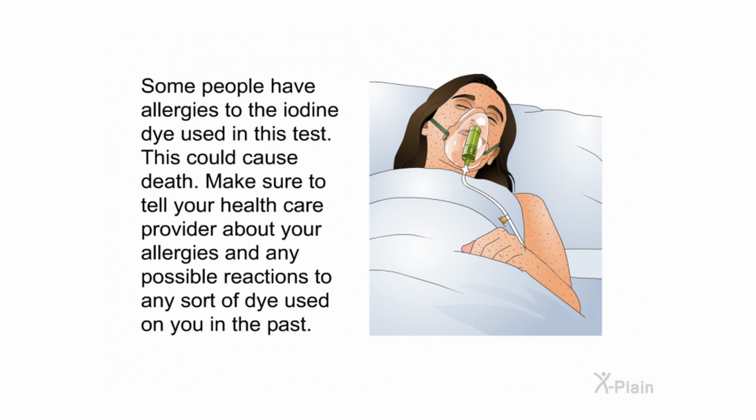Some people have allergies to the iodine dye used in this test. This could cause death. Make sure to tell your healthcare provider about your allergies and any possible reactions to any sort of dye used on you in the past.